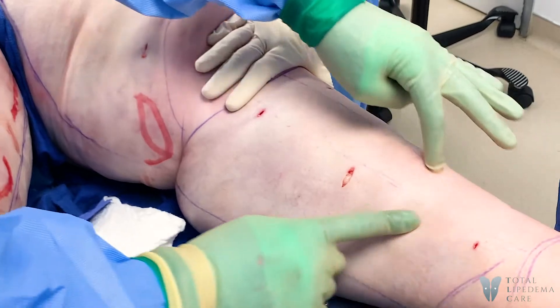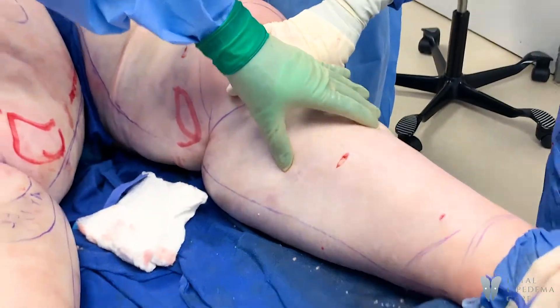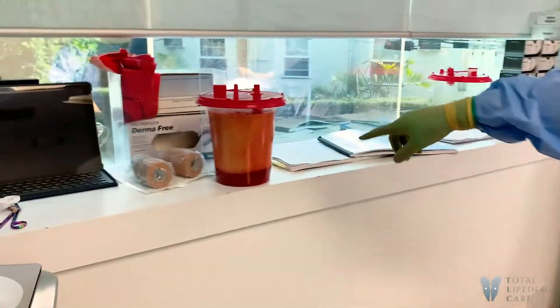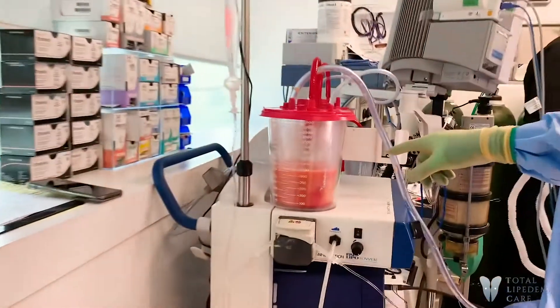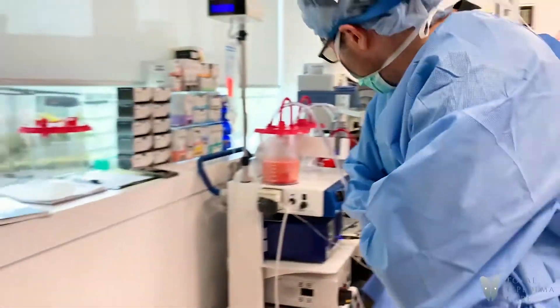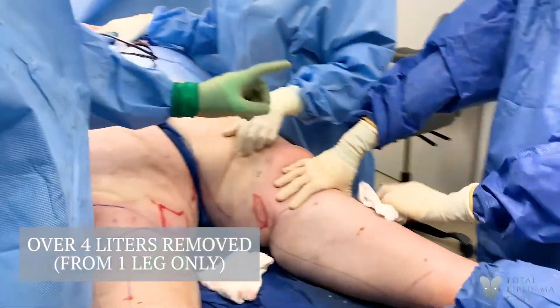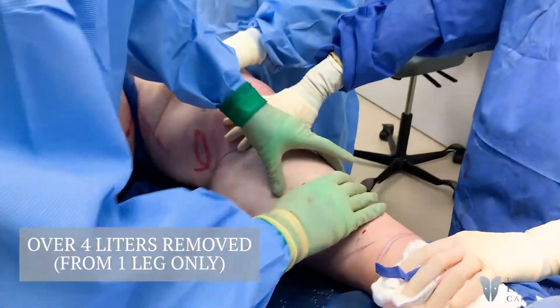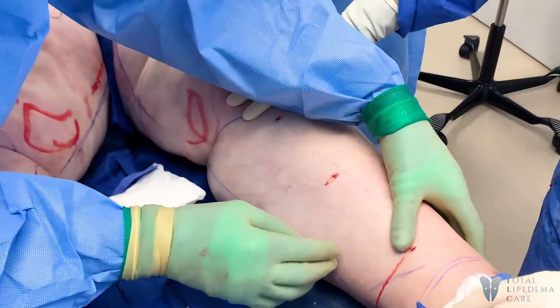We've actually done our lymphatic sparing liposuction. I want everybody to take a look — that's just from one of the legs. We still have more to go; this is only one leg total. We've gotten close to over four liters from just one leg, and we still have more to go. We've done the lymphatic sparing liposuction and there's nothing left in here.